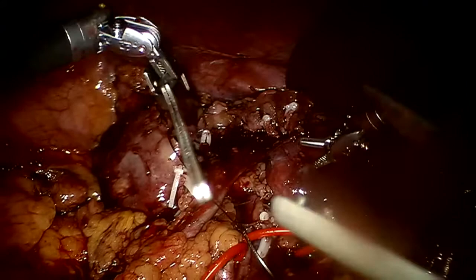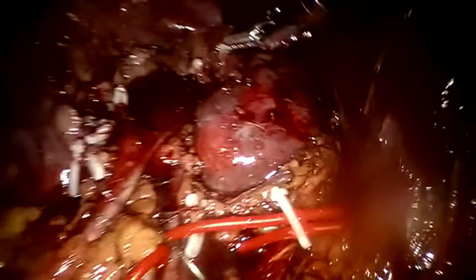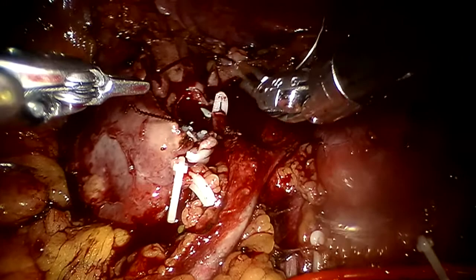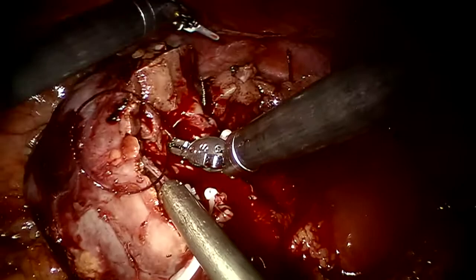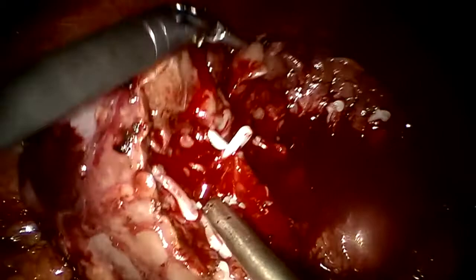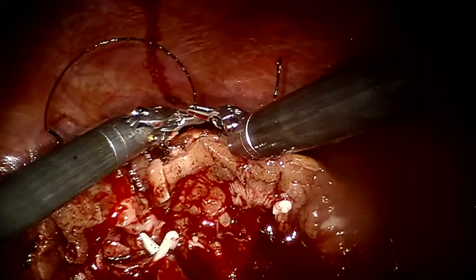So the hemostasis is not because there is no arterial supply. It's because the clips work in allowing us to do this. See, we were strategic in our wet clip placement. And so, Tulio and Vincenzo, you can see that I have sutured barely 15% of the kidney, and yet the hemostasis is not bad.